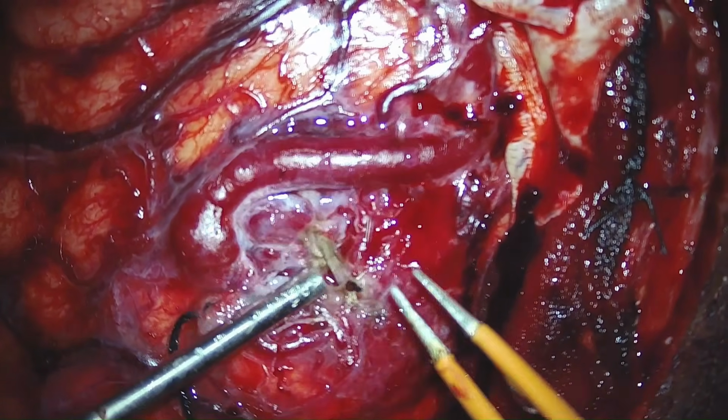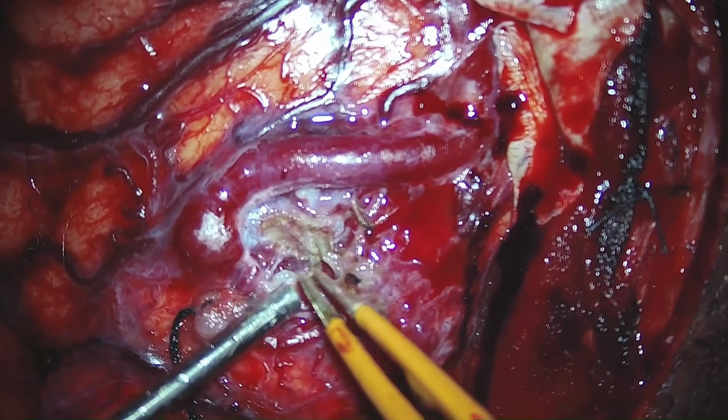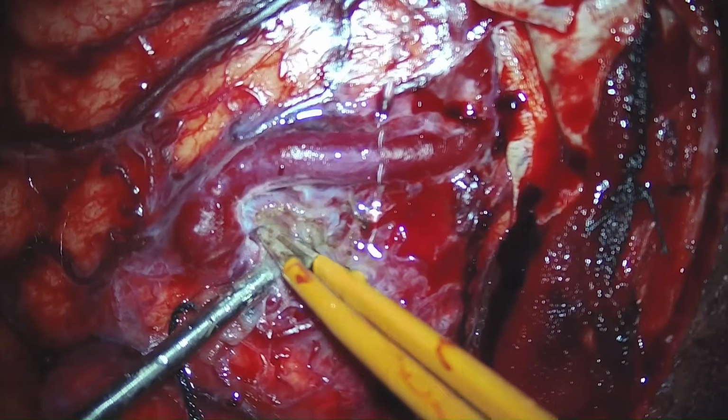We slowly started coagulating the AVM nidus itself, and we have separated it from the parenchyma.